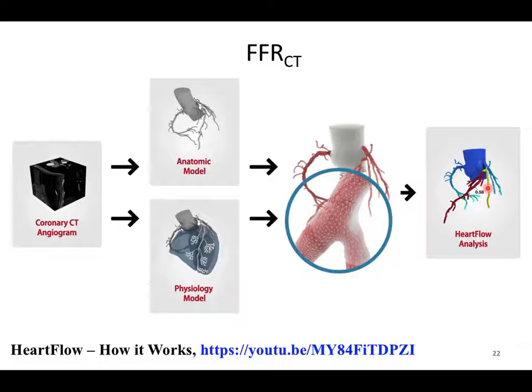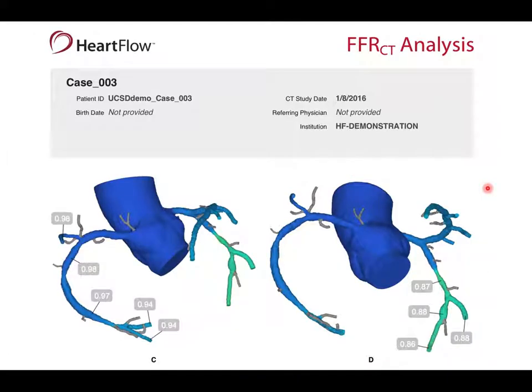But perhaps even more importantly, it's those patients who don't achieve an FFR that shows a greater than 20% drop. You can tell them, you don't even need to go to the cath lab, right? Just go on optimal medical therapy. You don't go to the cath lab and get invasive FFR done, because we know you're going to be well above the threshold for getting treatment.